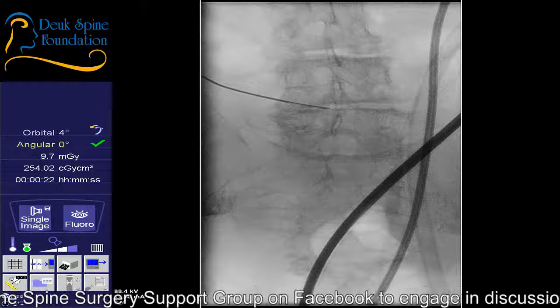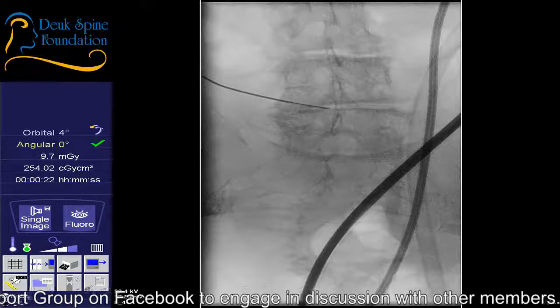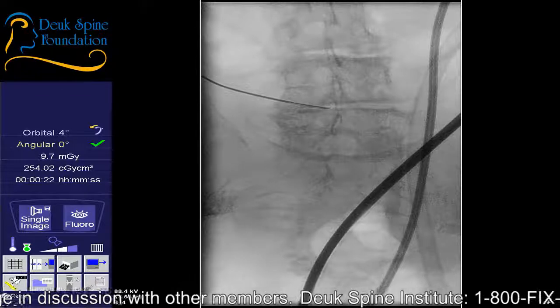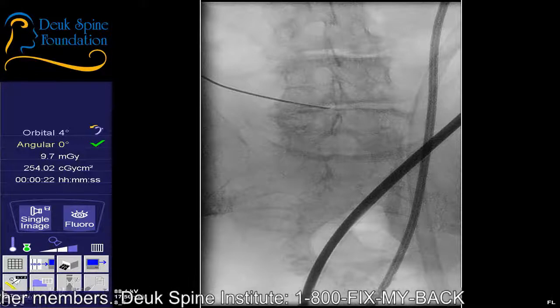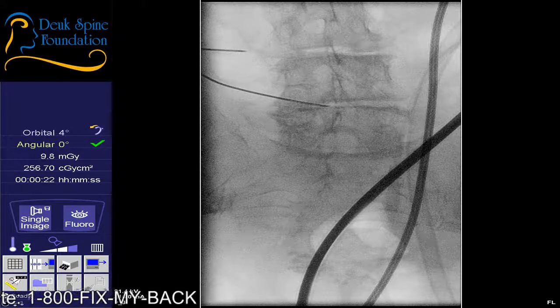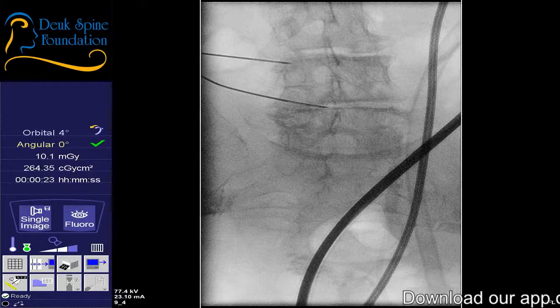So for those of you wondering, is this percutaneous? The answer is no. Percutaneous procedures, there's no incision made ever. Otherwise it wouldn't be percutaneous. Percutaneous means through the skin with a needle. Up to this point, it was percutaneous, but now it becomes a real surgery. Percutaneous procedures are not real surgeries. That's why they're called procedures. They're needle-based procedures, not real surgeries. But, you know, there's no real strict definition. So some people will call percutaneous procedures surgeries, other people won't. In the strictest sense, they're not. And they're actually not done by surgeons.